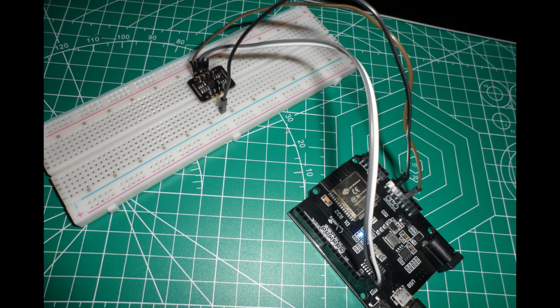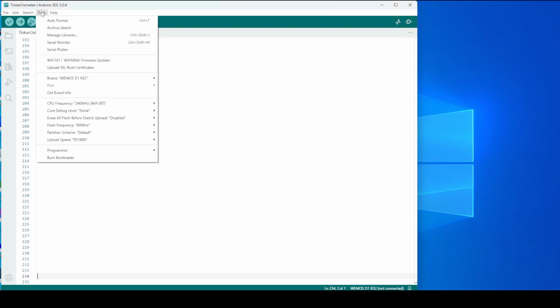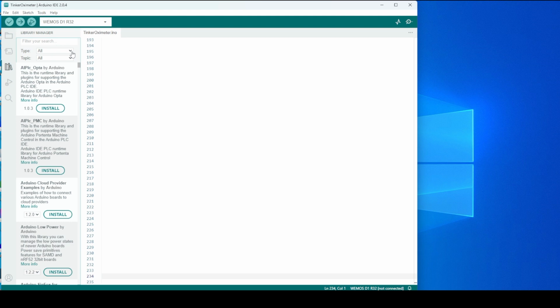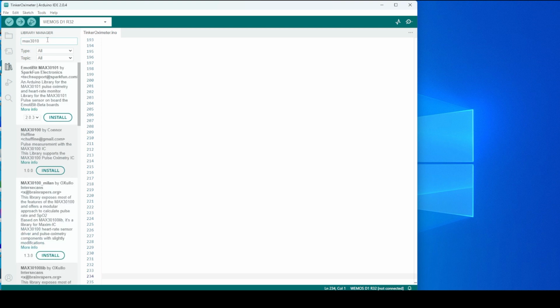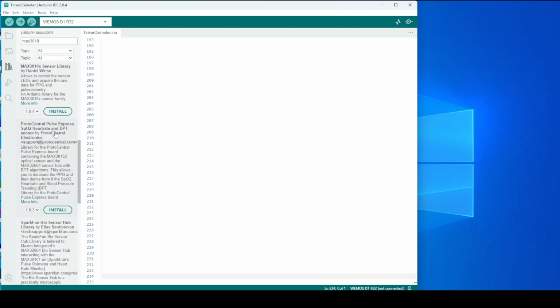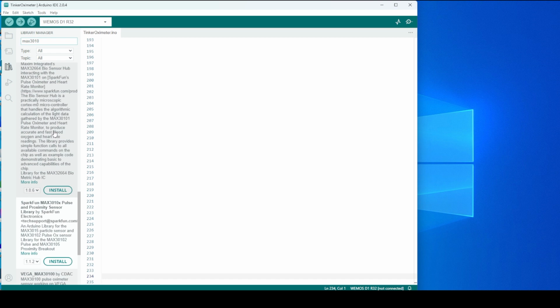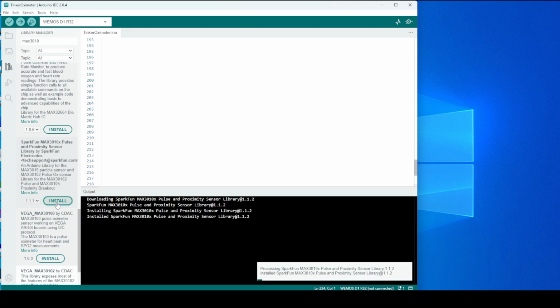For the C code, which we'll be compiling and uploading via Arduino IDE, you'll want to install the SparkFun MAX3010X pulse and proximity sensor library through the library manager. Now, oddly enough, if you attempt to use the example sketches associated with that library, you'll have a tough time. I got some nonsensical results, and from what I've seen online, this is a common issue. You'll want to use code based on what's in the GitHub repository. Again, I'll share the modified code I used in this video. You can study the code on your own, and there isn't much to it really.